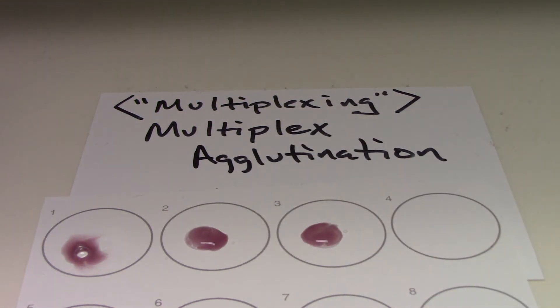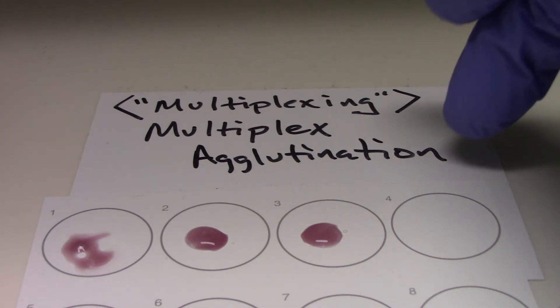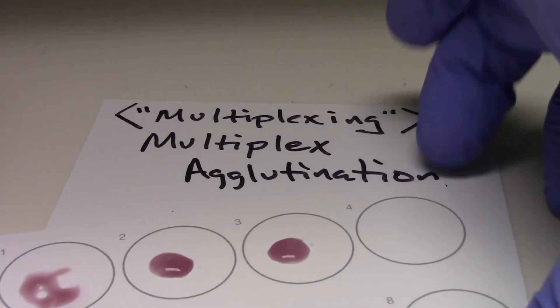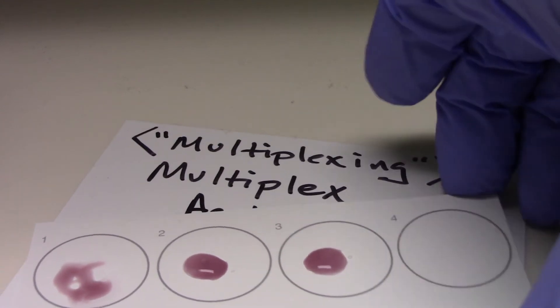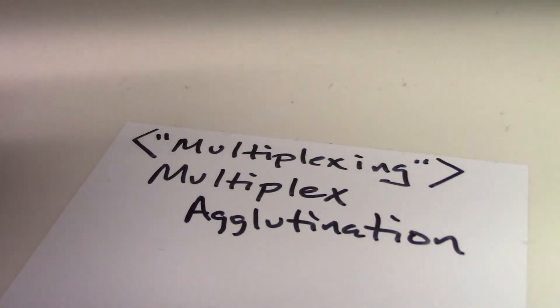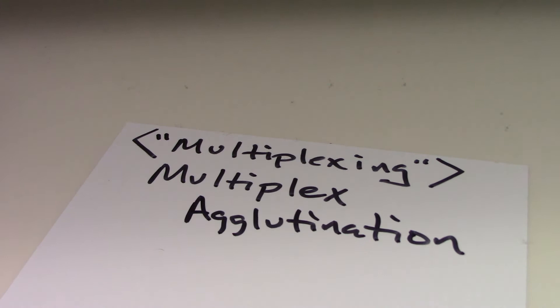This is our mixture of antibodies. Now, what I'm going to do with this is I'm going to place it on a rotator. That rotator will mix the specimens.